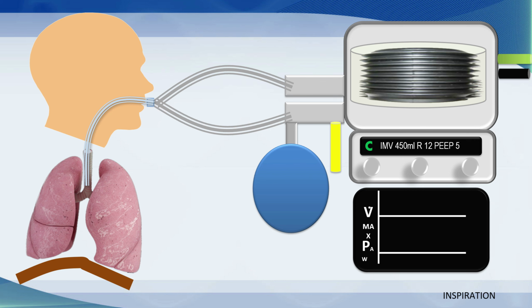Well, let's start in the 1950s and 60s when mechanical ventilators were not sophisticated. These were mechanical machines. There was no real electronics in them. And the early machines, as I've mentioned, were used in both the operating rooms and the ICU. What you notice that's different about this machine versus what I showed you earlier on is that there is a bag on the expiratory limb.